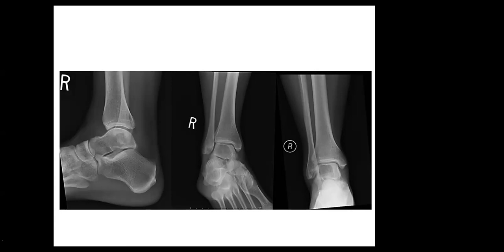It's a list of imaging features on the radiographs that you need to describe, because your description will determine whether the lesion is aggressive or non-aggressive. Based on that, you would make a recommendation for further imaging.